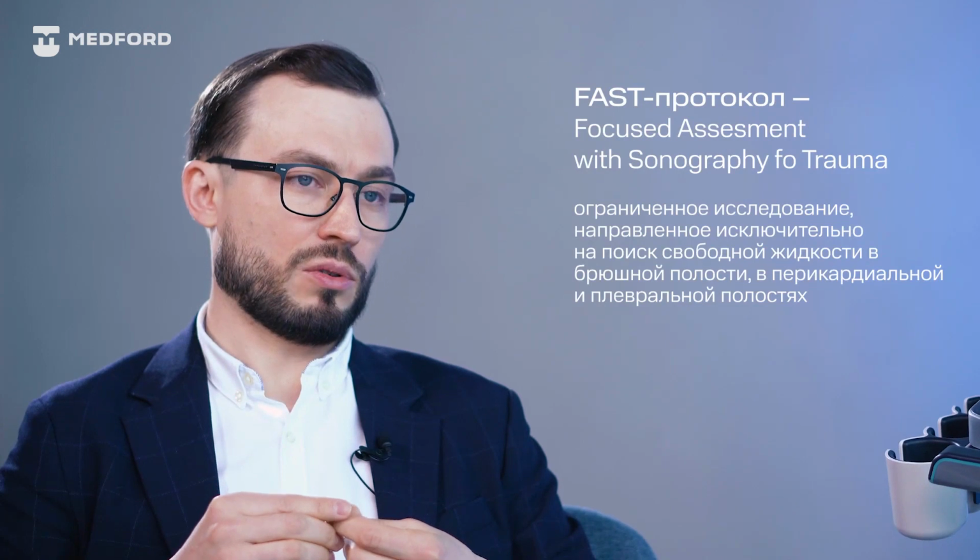This is the FAST protocol, or focused assessment with sonography for trauma, which includes the diagnosis of latent blood loss: abdominal cavity, pelvic cavity, pleural cavities, tamponade, pneumothorax, what we can see, and what allows us to change the tactics of management. This will be very important in connection with the opening of new assistance complexes, which in Moscow are opening 6 emergency inpatient complexes in which patients with trauma will be admitted.